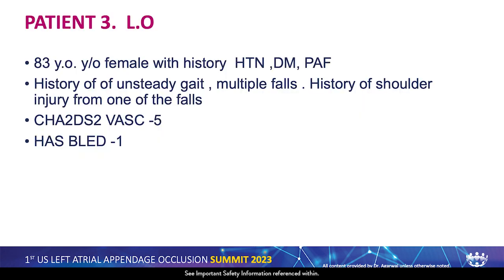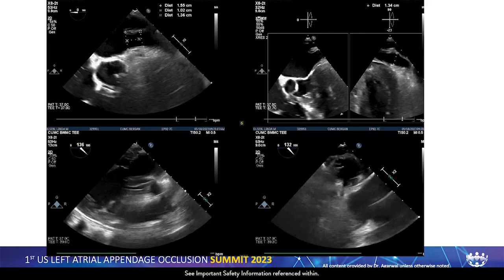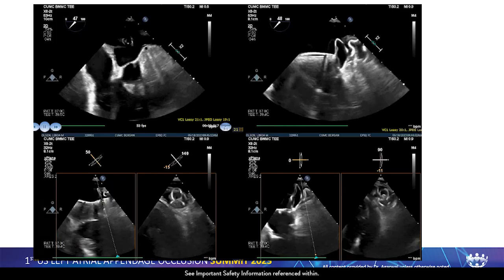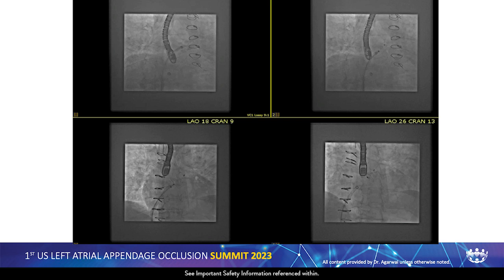Third patient: 83-year-old lady with CHADS-VASc 5 and HAS-BLED 1. The anatomy was very different — very difficult to get adequate TEE images because the patient has a very rotated heart. The Coumadin or PV ridge is very prominent, almost extending to the mitral valve level. Here you must go inferior and a little anterior — mid to anterior — otherwise you'll run into this ridge. Before puncturing, I modify my trajectory on the transseptal needle pointing it right towards the appendage opening. Once the puncture is done, the Versacross wire falls right in the appendage. This lady had a bi-lobed appendage, heavily pectinated, with a very prominent PV ridge — with a good transseptal puncture it was done in one shot, one deployment, no recaptures.